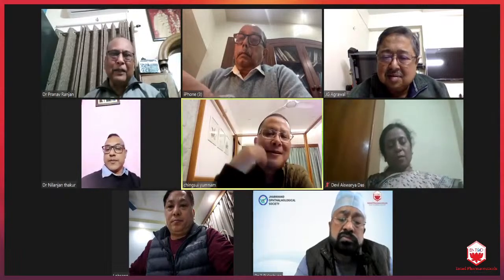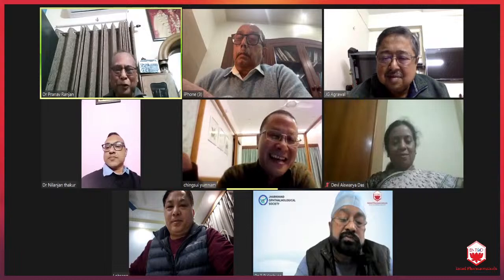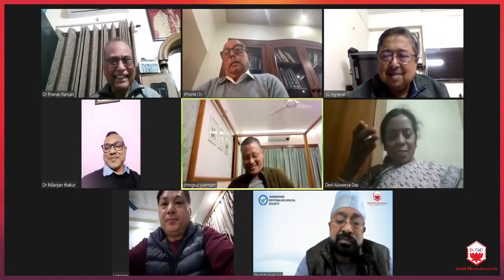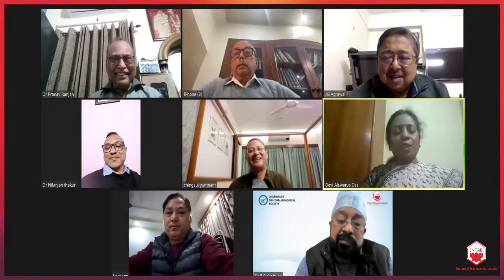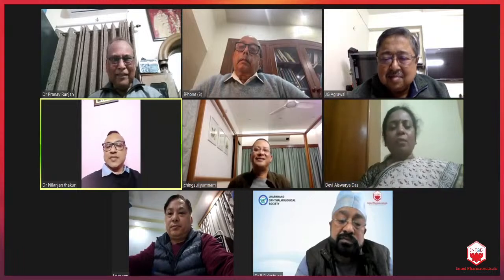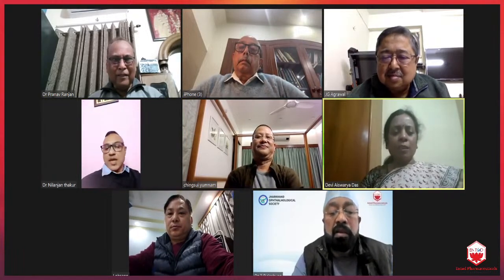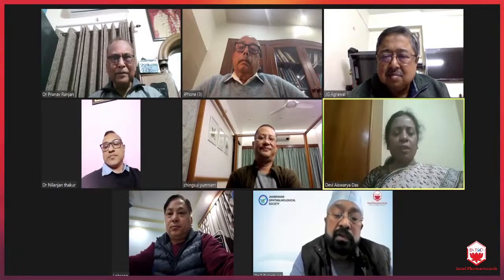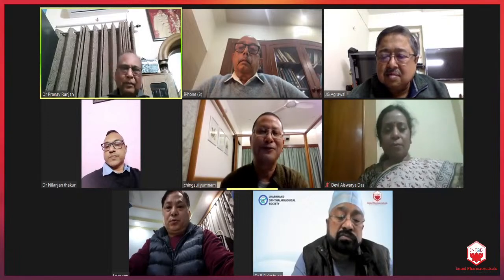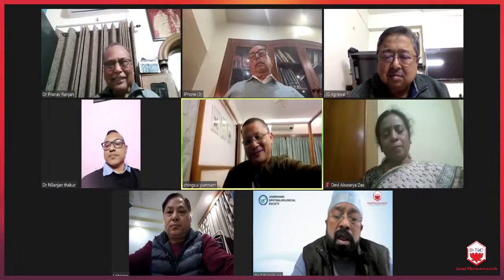Dr. Thakur, that is okay, that is understandable, but the discussion was about a situation where you could not do the axial length measurement. It's difficult to find. There's more chance that you can't do a keratometry, but usually you can do an axial length. Exactly. But doing this eye, then doing the other eye, and giving an IOL by comparing with the other eye's refraction, that can be done. So it would be a very rare situation where you can't do an axial length. That is my whole argument, basically.